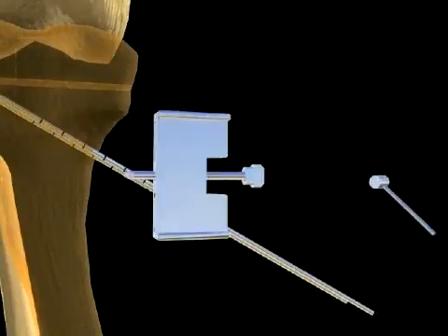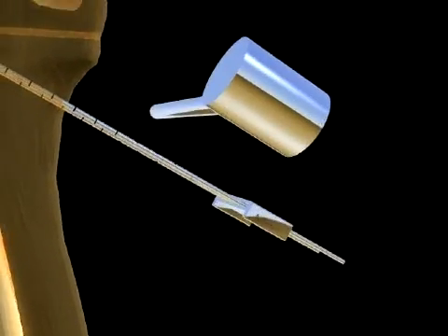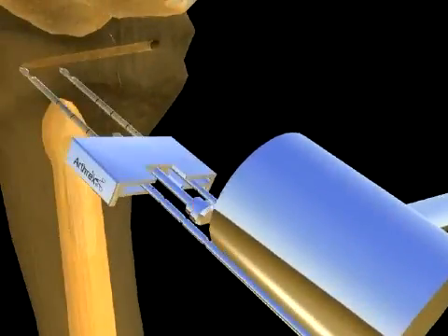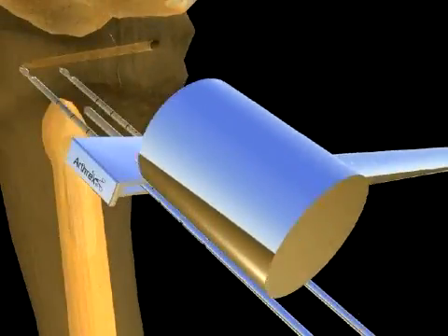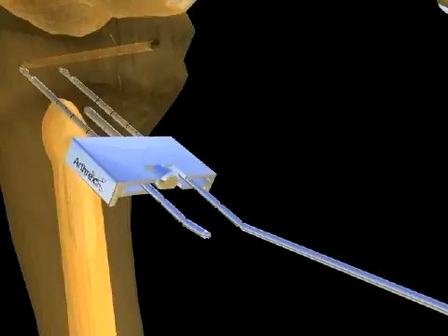The cutting guide is positioned over the distal pins. The guide may be secured by placing a temporary pin into the tibia with a mallet. The breakaway pins may be shortened to facilitate access of the saw to the cutting guide.